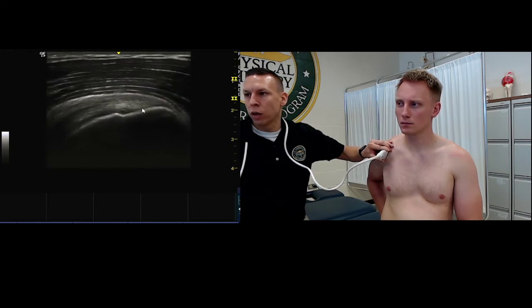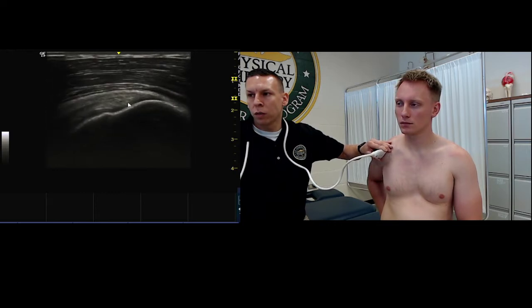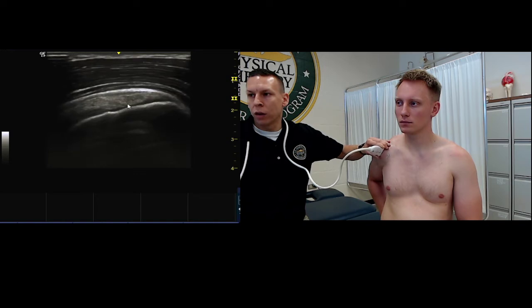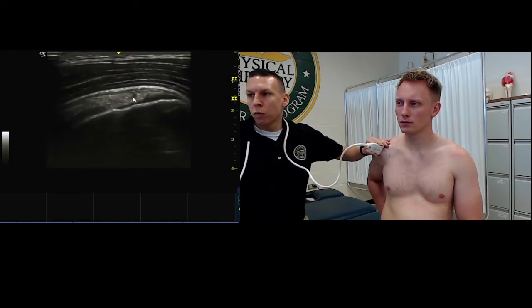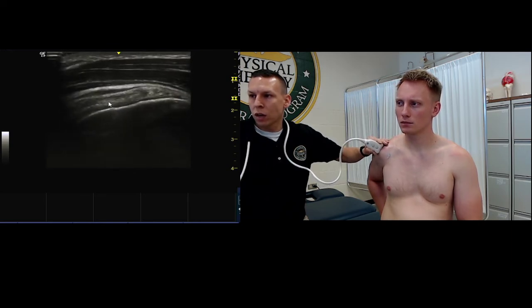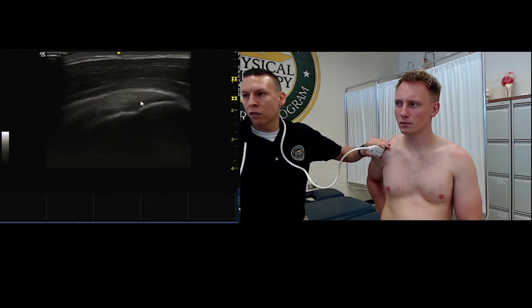And this is where we really want to take our time, look at it here, and then we want to slide from anterior to posterior. As we move posterior, you might need to move your probe just a little bit. It should flatten out a little bit. And as it flattens out, you might see some orientation of fibers coming in different directions as we move more posteriorly. That's just because you're going to start running into the infraspinatus.